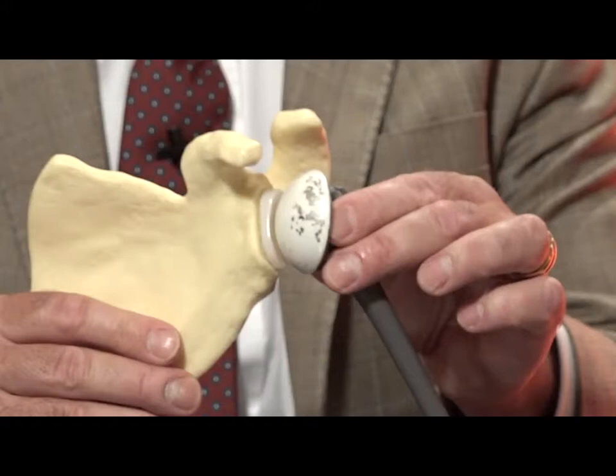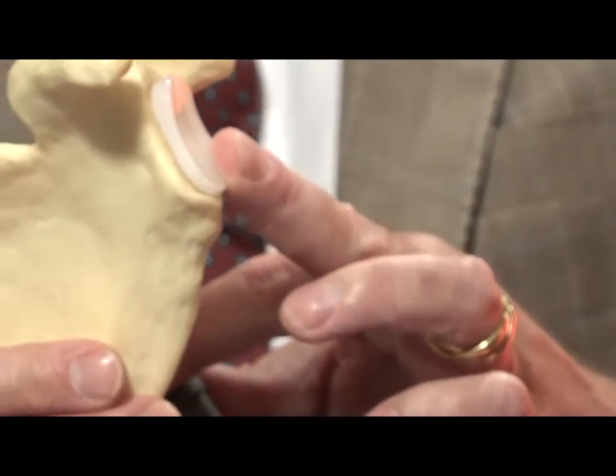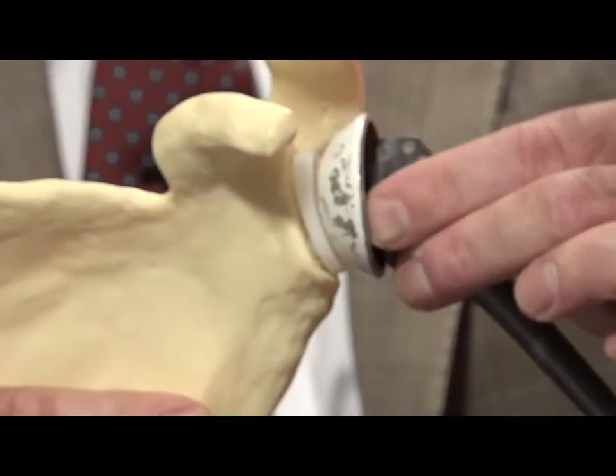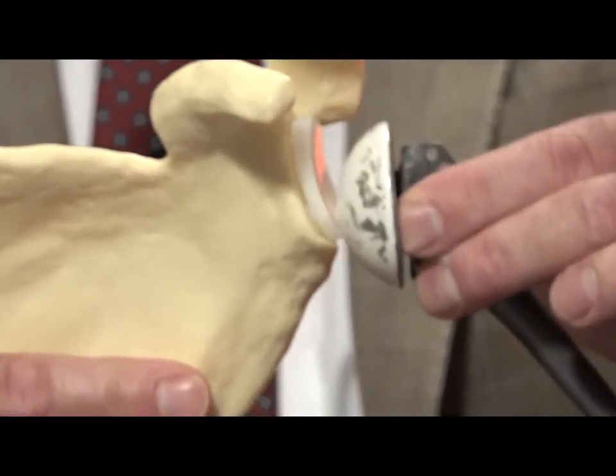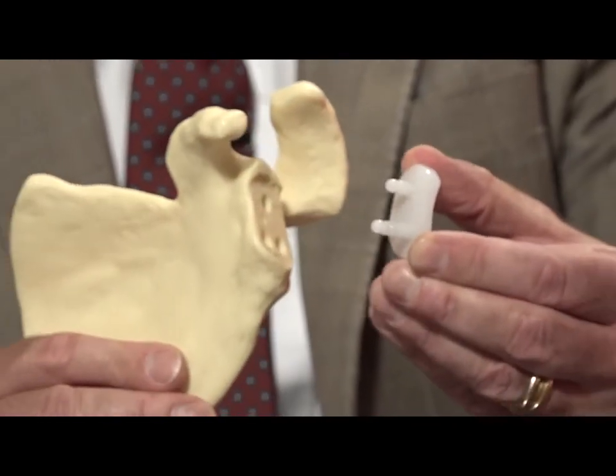The problems encountered with current shoulder replacement models are based upon the fact that the glenoid sits on top of the bony surface. So when the humerus goes up and down and rotates and slides back and forth, it rocks the glenoid loose, potentially, because it's sitting on the surface, as you can see here.